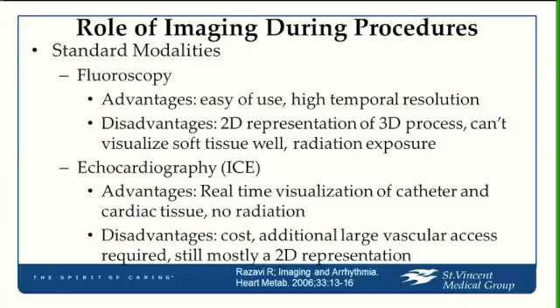Not only does it have the radiation exposure that we heard about, and not only do the operators have the orthopedic problems because they're using lead, but fundamentally, fluoroscopy, just like anything in X-ray, is a two-dimensional representation of a three-dimensional process. And it also doesn't visualize soft tissue. Now, I've been in the EP field. I passed my boards 20 years ago, so I'm coming up on recertification. But the first non-fluoroscopy imaging modality that came in for procedures was really intracardiac echocardiography.